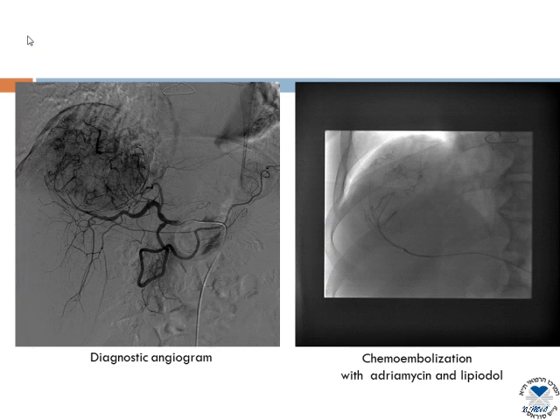A typical patient, I mean, I wish this was a typical patient, but you can see on the left a hypervascular mass on the diagnostic image. On the right, followed by a microcatheter insertion to the vessels feeding the tumor with the adequate arterial blush, which is the point where the drug mixture is being injected from.